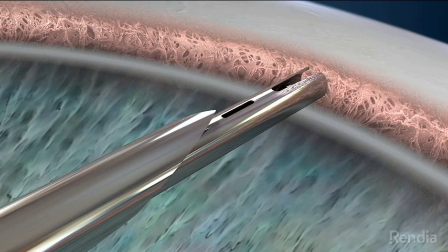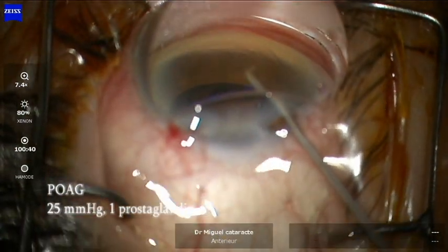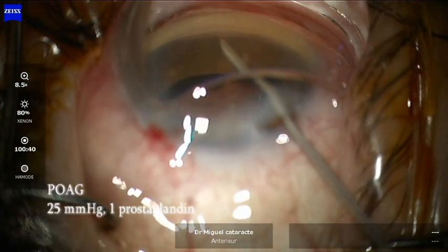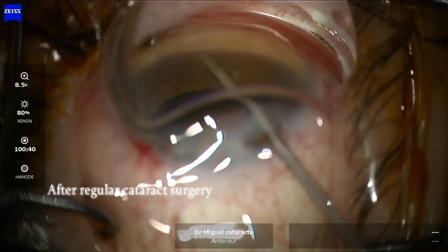We must tilt 35 degrees the microscope and 35 degrees the patient's head away from us, then put delicately the gonioprism above the cornea.